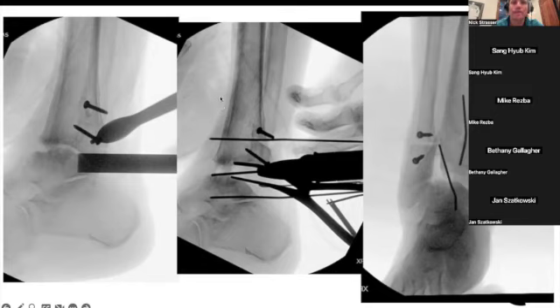I was just curious. It's one of those things that you ask for and then they bring it in and they don't have the handset for it, or they're dull, and it doesn't work. A couple of questions here real quick. So it's the low speed, high torque MIS burr? Yes, that's correct.